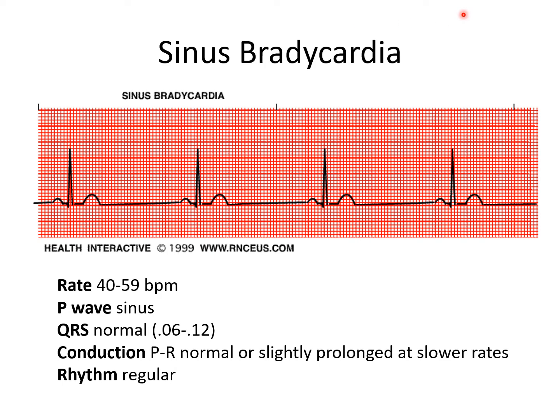Let's take a look now at sinus bradycardia. First, we're going to look at the tracing and double check that our strip is 6 seconds, and indeed it does. So we can go ahead and begin to interpret this finding. The rhythm sinus bradycardia is often seen as a normal variation in athletes, during sleep, or in response to a vagal maneuver.